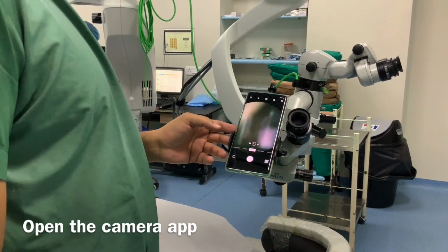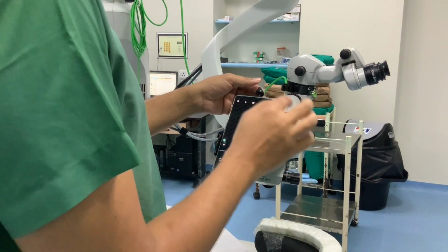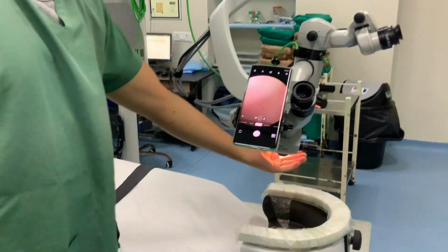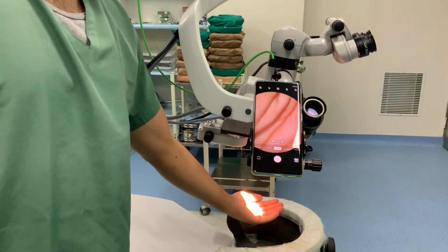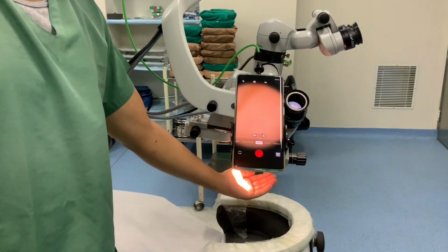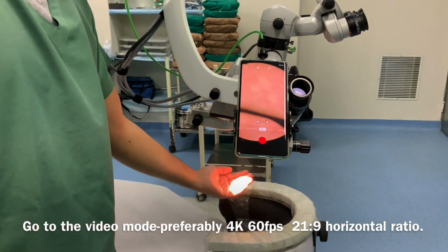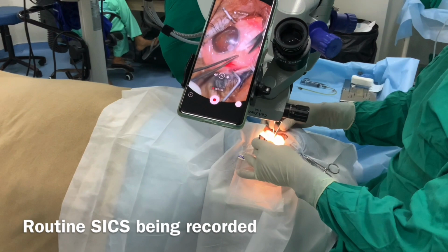Go to the camera app. Check for the pop-up illumination on the screen of the smartphone. Now, my advice is to go to the video mode, preferably 21:9 horizontal ratio 4K recording mode.